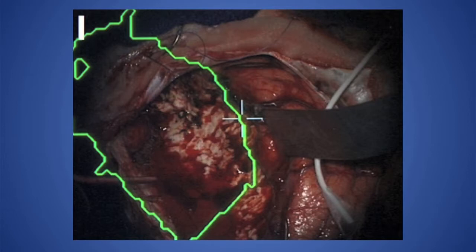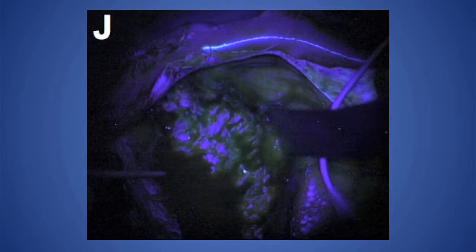There are many things that we rely on, an accuracy of where we are and a definition of boundaries that exceeds what somebody's sense of where they are. You still require that, but you could not do many of these surgeries today without these technologies. Tumors lent themselves first to this because they were being identified on CT scans and MRI scans, and you had to know where they were, you had to find them. It's a very structural problem, and they're embedded typically in the tissues, so that idea of locating them and knowing their boundaries was useful. And most people just say tumor, tumor, tumor. That's certainly true for image guidance, it's true for fluorescence technologies. But the reality is that these technologies are directly applicable to many other areas of surgery.